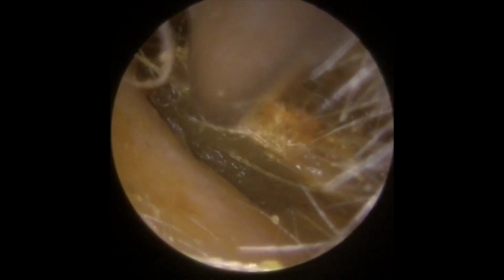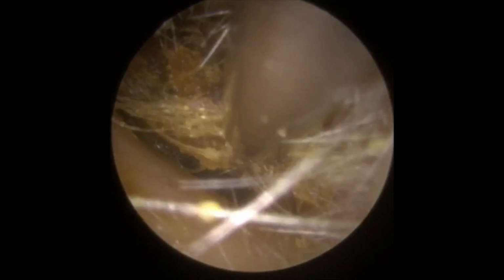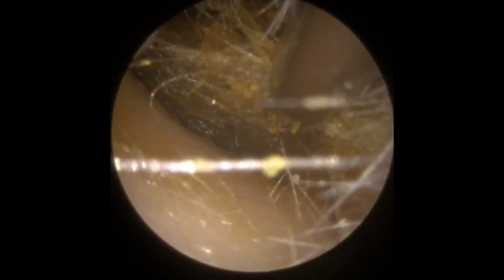Now you can see there's quite an angular piece at the front end of this wax, lots of hair embedded in it as well. So I'm just going to try and break this front section away, so it leaves me a flatter surface to get a better suction grip on. It's not quite solid enough to get the forceps in here to grab hold of it.